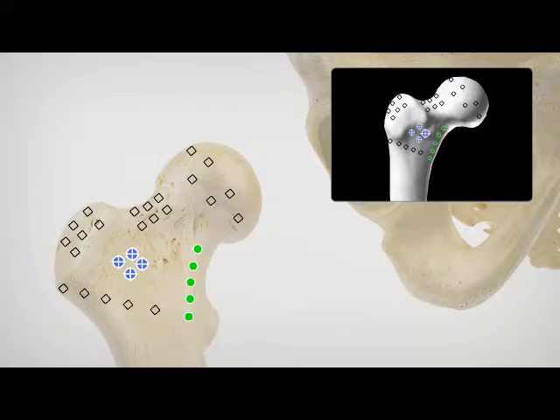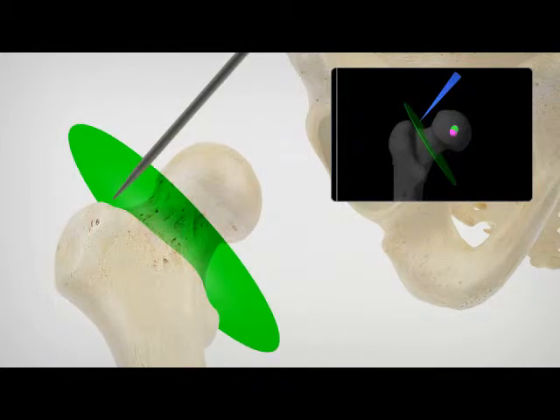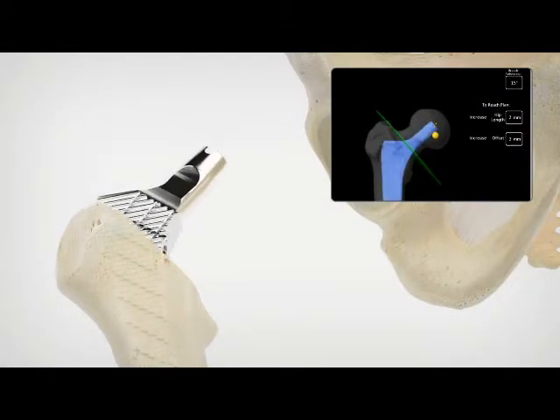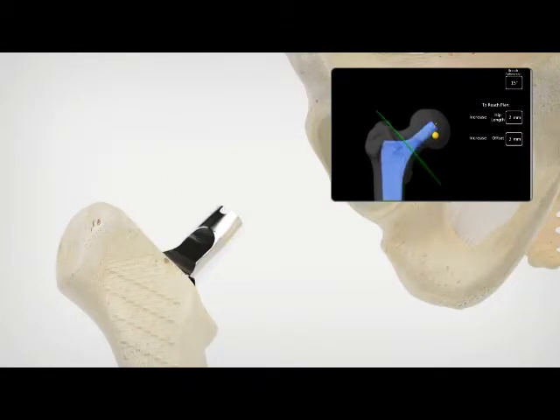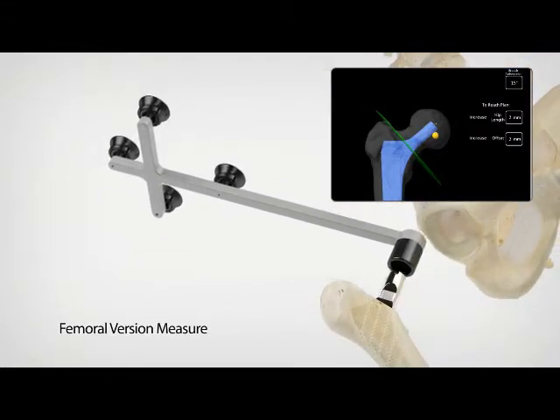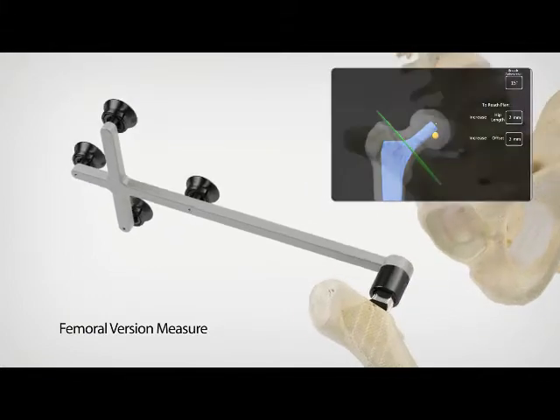The surgeon plans and accurately defines the level of the femoral neck resection in order to achieve ideal leg length restoration. Once the head of the femur has been removed, the femoral canal is prepared using broaching instruments. The broach tracker is applied on the taper of the trial femoral stem and femoral version is measured.